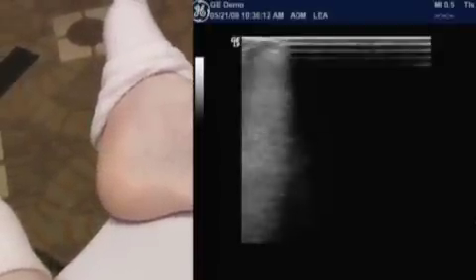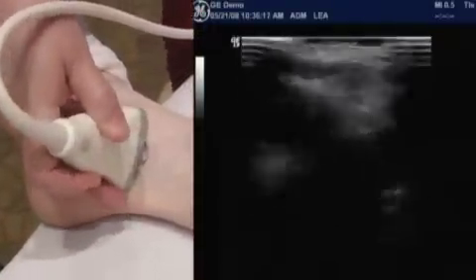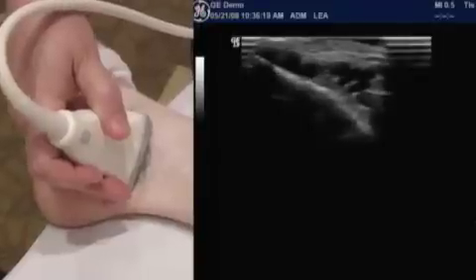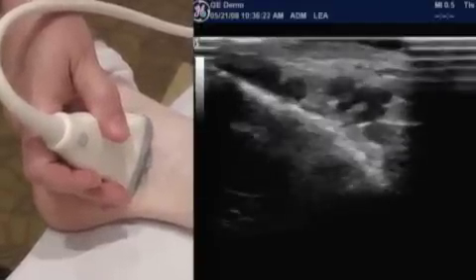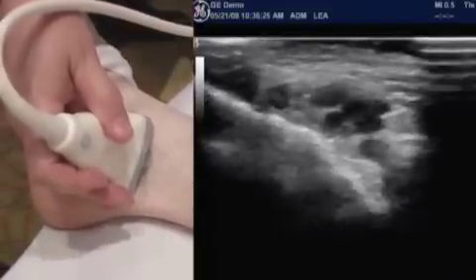Depending on the reason why we were scanning a patient, we would include really following the vessel all the way down here to behind the ankle, as well as when we come around, we'll follow the dorsalis pedis on top. So we want to get all the way down to these pedal vessels because it's those pedal vessels that may be an outflow source for some patients. I'll just show you down here, when you do a regular Doppler, where you're putting your transducer to listen for an ankle pressure. It's the same kind of thing that we're going to do here.